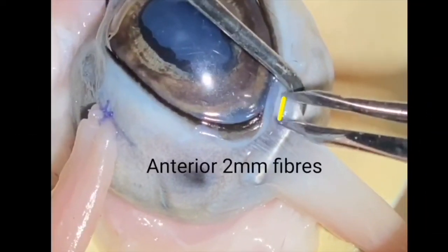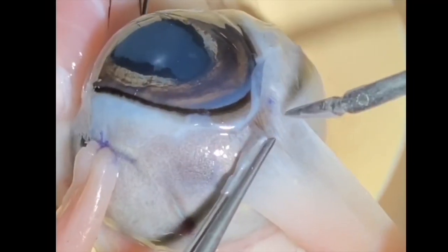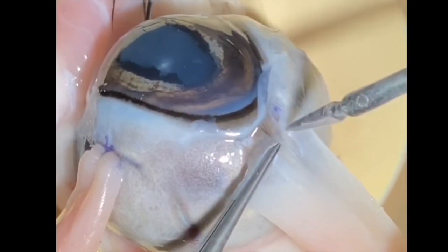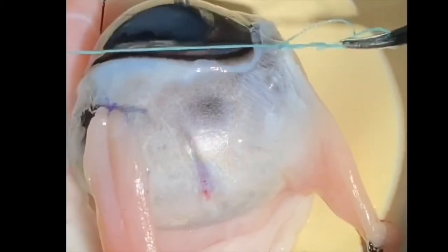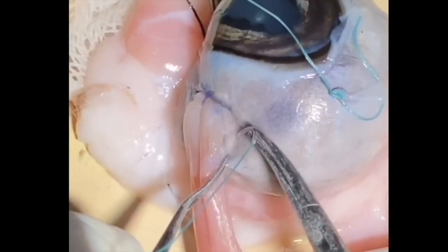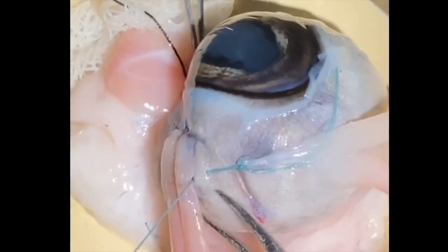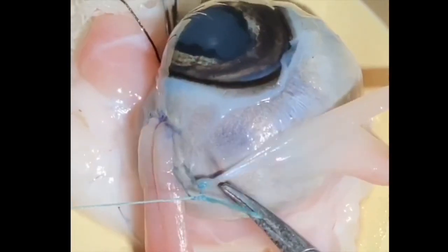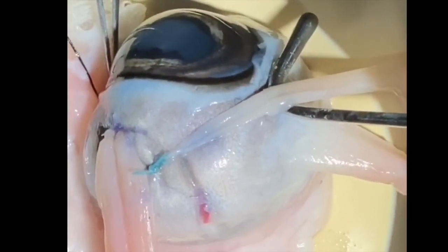To perform the Harada-Ito procedure, anterior 2 mm torsional fibers are identified. These are separated from the posterior fibers using a Vannas scissor. The anterior torsional fibers are secured using a 5-0 ethibond suture and these are disinserted. These are then advanced anteriorly and sutured posterior to insertion of lateral rectus approximately 8 mm from the insertion site.